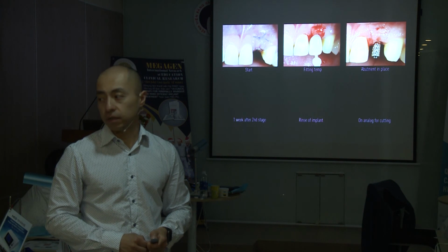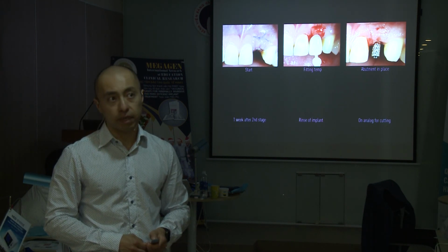It's a temporary cylinder abutment to make temporary screw retained crowns.